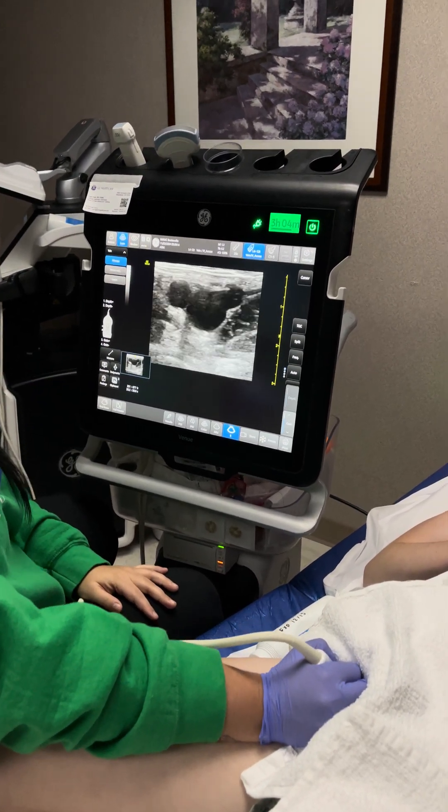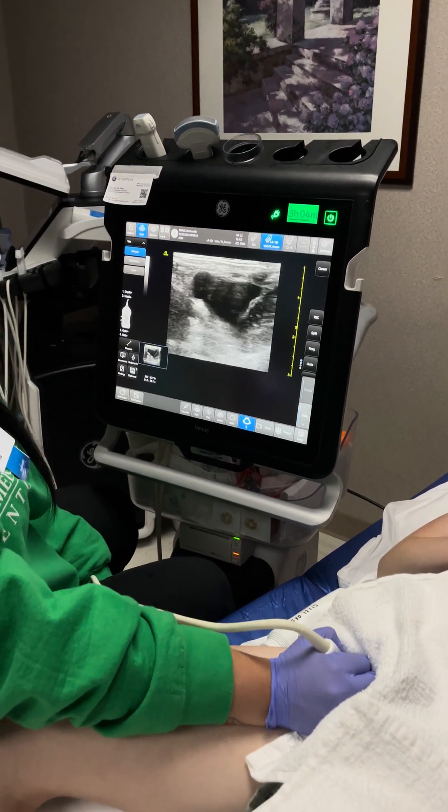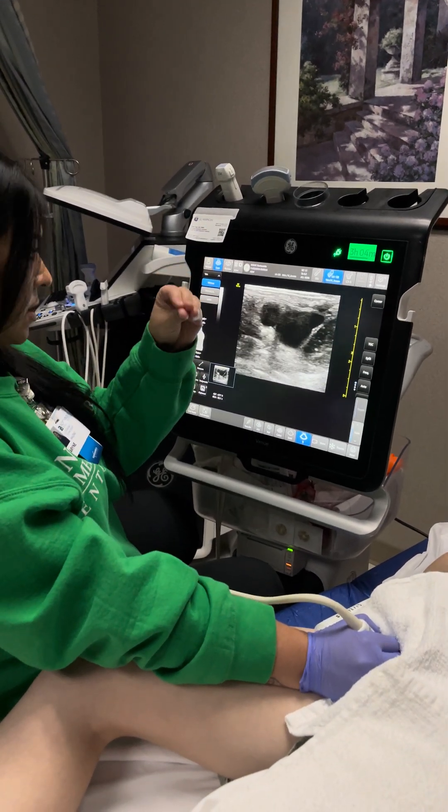Sometimes it's a little bit harder to press depending on the severity of their leg, but you just press it and it compresses. If it was not to compress, we would know something's causing it not to.